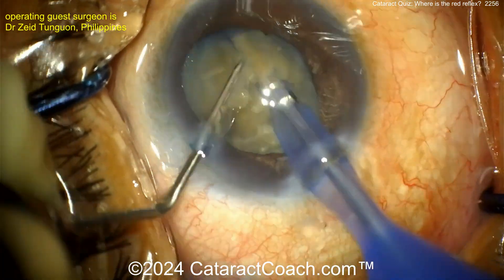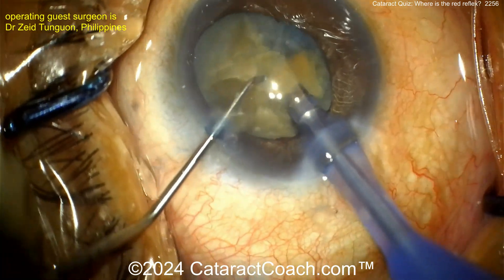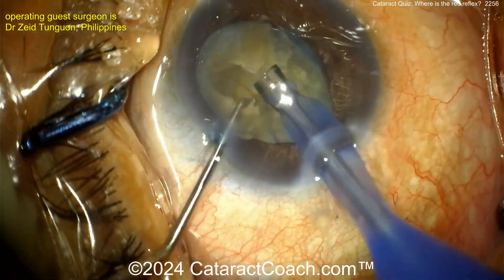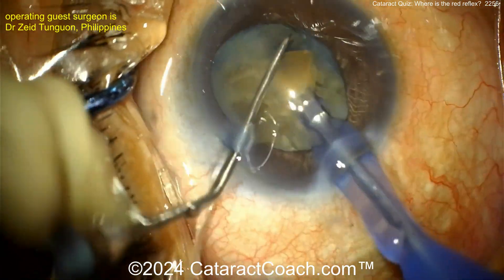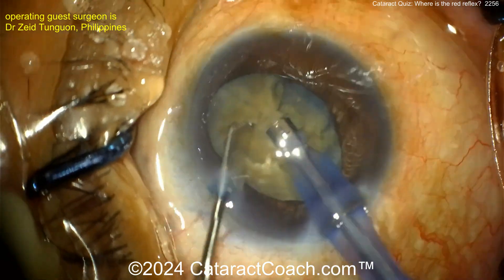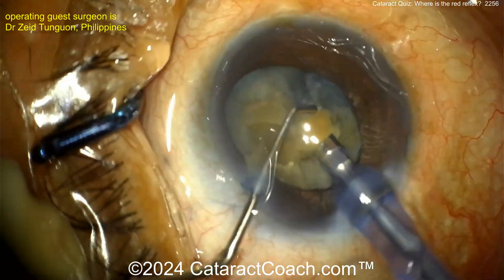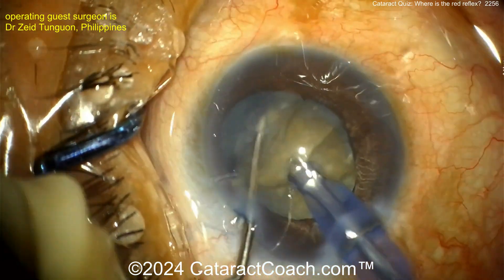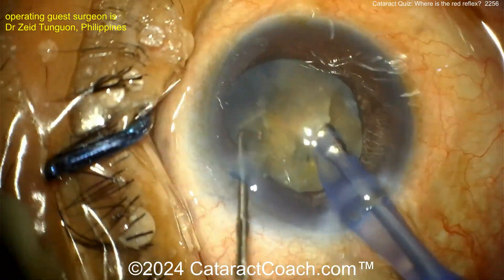You don't have to go into the vitreous cavity and take out the trypan blue dye — you can actually just leave it. The patient will have cyanopsia, a bluish vision for a while, but it'll eventually absorb and resolve, and the patient will be pretty happy. The more important issue at this point is to be careful of weak zonular support.